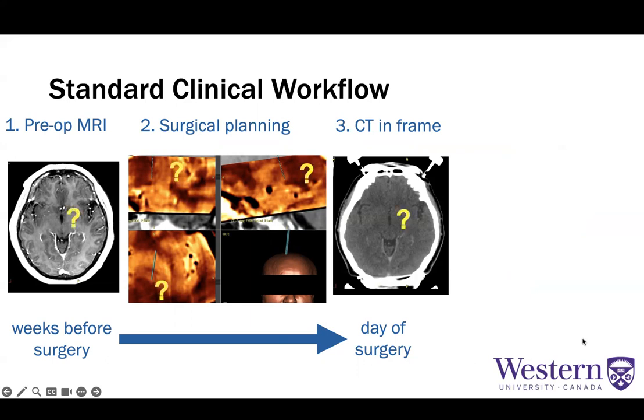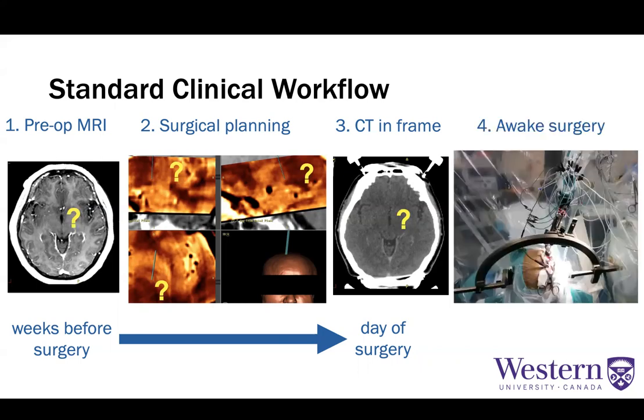Now, due to some uncertainty with regards to the location of the target, one of the tried and true methods for ensuring that we are in the right spot is to perform these procedures awake, or certainly with some type of intraoperative data that allows us to be sure that we have reached the target that we expect to.